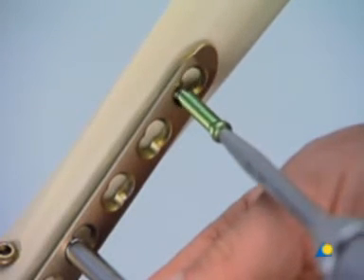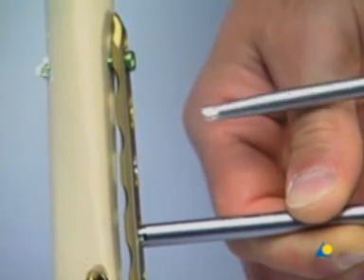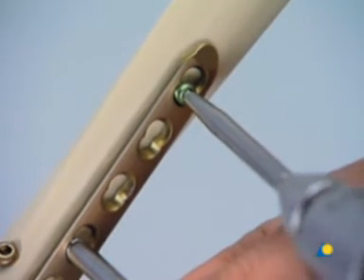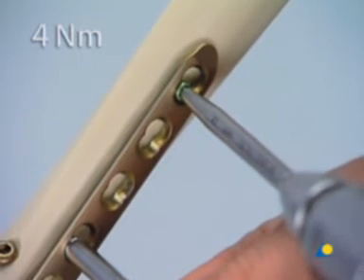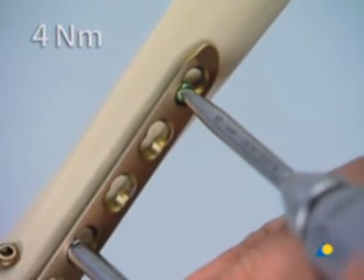A self-tapping locking head screw is inserted. The screw head is locked in the plate by hand with the torque-limiting screwdriver. When the maximum of 4 newton meters is reached, a click is heard and felt.